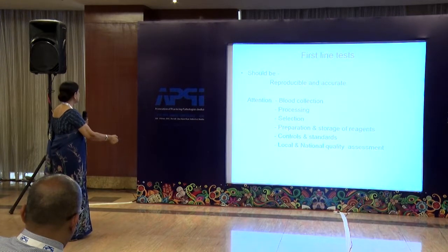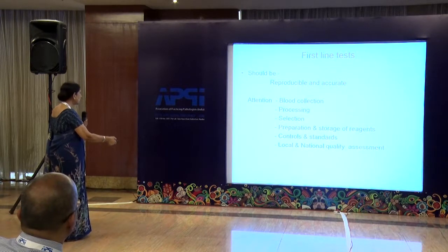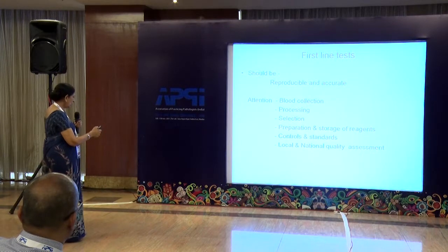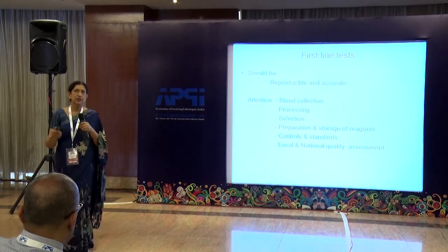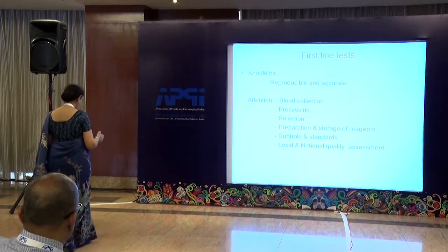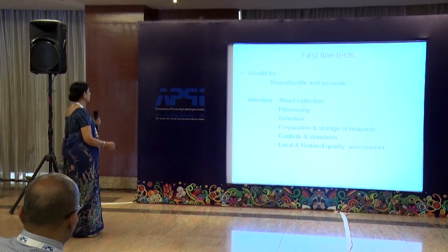So attention has to be given to blood collection, processing, selection of the reagents, and what tests you are going to do. How do you prepare and store your reagents, controls and standards? And you have to be part of a national or a local quality assurance program. It is absolutely necessary that you participate in any one of these quality assurance programs.